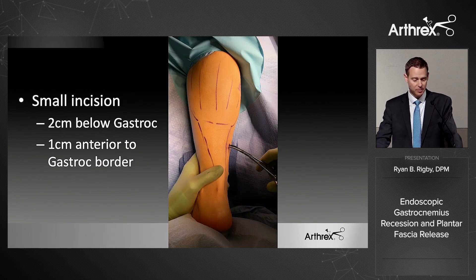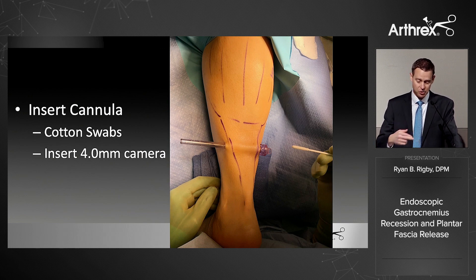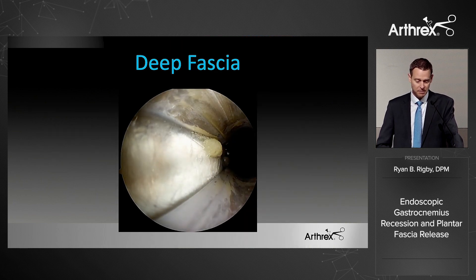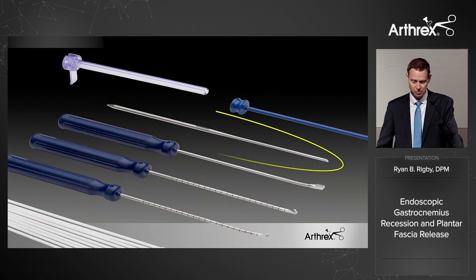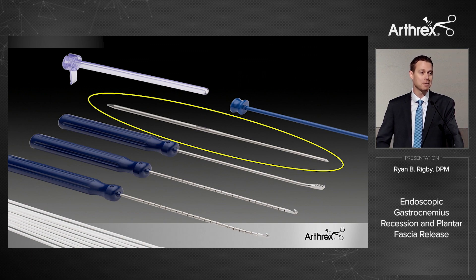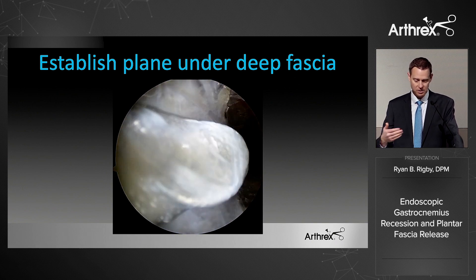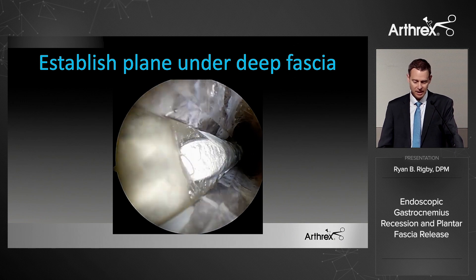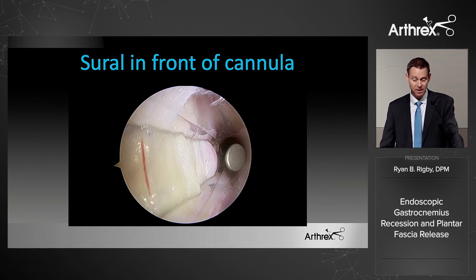The technique: make your entry a couple of centimeters below the inferior border of the gastroc, about one centimeter in front of that border, starting on the medial side. I take a hemostat across gently first, then insert the cannula. This works with a dry arthroscope. You can see the deep fascia — move the foot up and down and watch the aponeurosis move. The kit includes a beveled dissector tool; I almost never hit the perfect plane immediately, so I use this tool to work through the tissue underneath the deep fascia and then use it as a switch stick to put the cannula in the right plane.